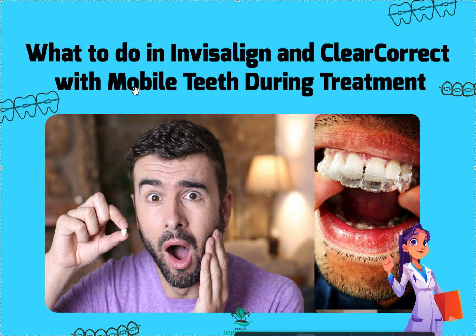Of course, I didn't mention initially, always take an x-ray, right? Because what if there's an infection or pathology or something else that's going on? The x-ray tells a lot of things. I'm looking at the PDL. Are we getting bone loss? Do we just have a widened PDL that needs to tighten up because we were too aggressive?